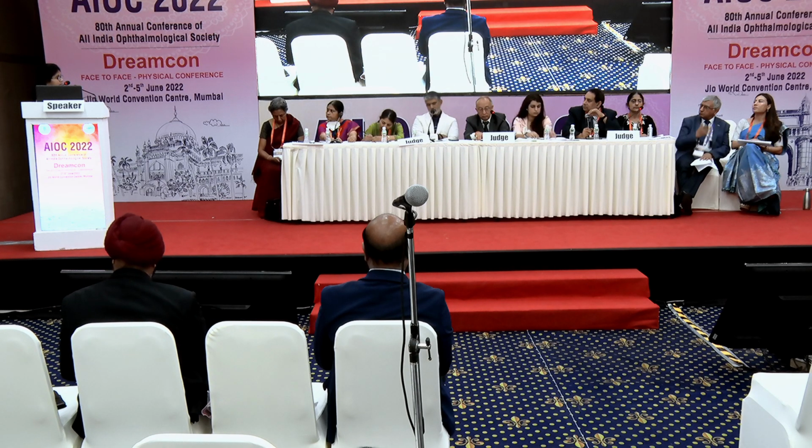One, probably as a result of optic neuropathy, there is loss of the GCL layer also, which due to the decrease in metabolic demand, probably affects the vasculature too. The second possibility could be that due to increase in edema of the disc, there could be a compartment compression kind of a system which is compressing the vessels also at that level. So still needs to be evaluated.